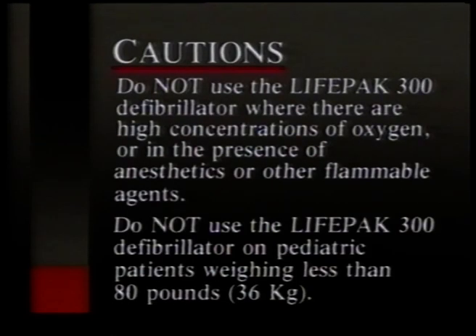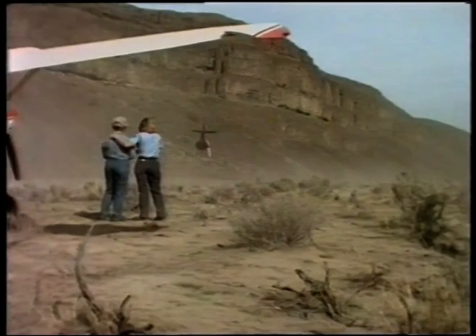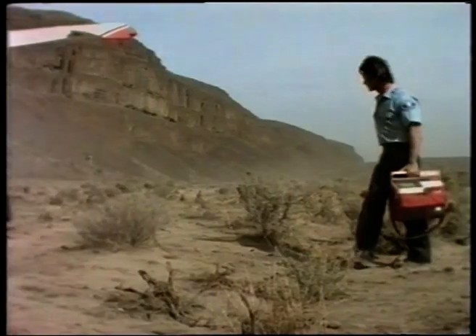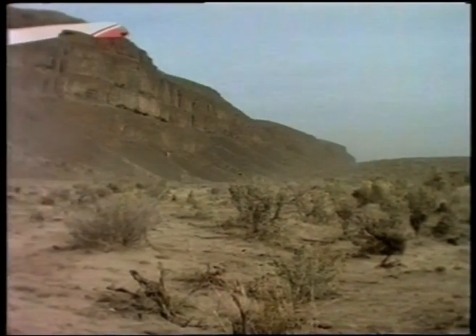Do not use the LIFEPAK 300 where there are high concentrations of oxygen or in the presence of anesthetics or other flammable agents. Do not use the LIFEPAK 300 on patients weighing less than 80 pounds. If the patient has a functional implanted cardiac pacemaker, the LIFEPAK 300 may not advise a shock regardless of the patient's underlying cardiac rhythm. An algorithm based on the American Heart Association's recommendation for the use of automated external defibrillators can be found in the pocket located on the top of the defibrillator.